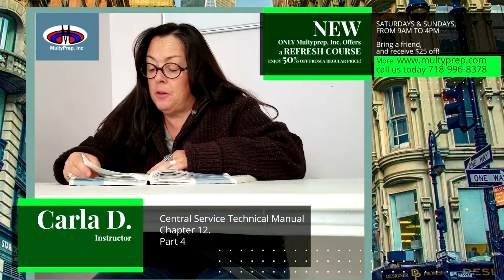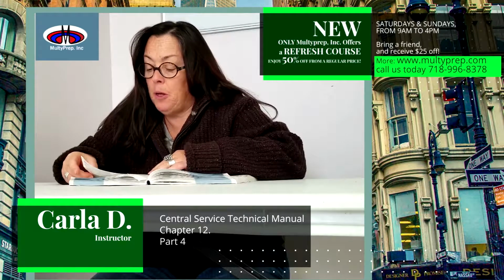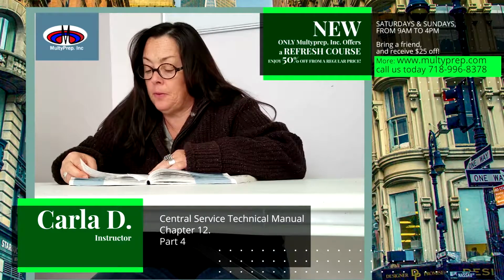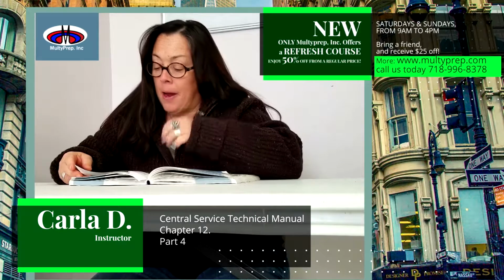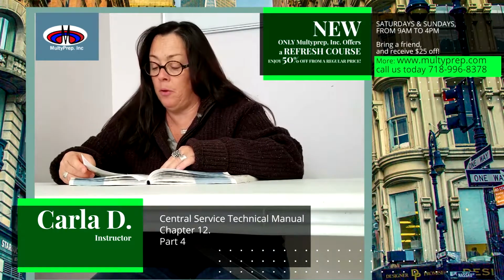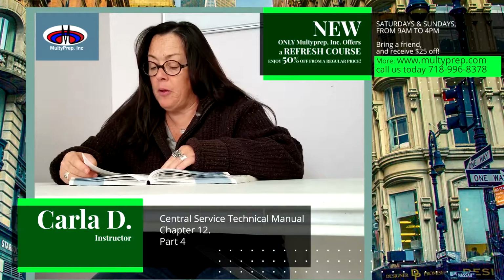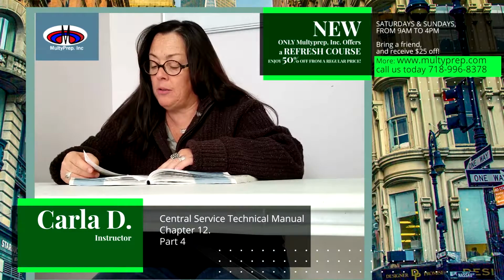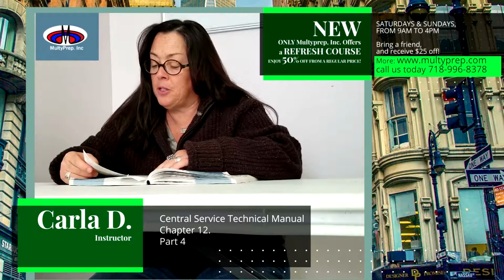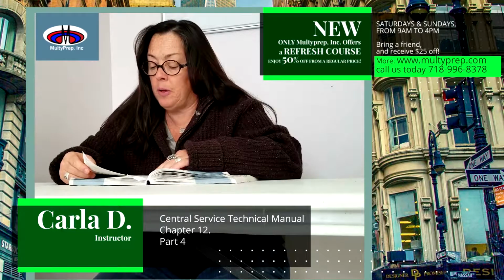Wrapping techniques. Peel pouching techniques are as follows. Peel pouches are usually used for smaller lightweight items. They are also useful when it is important to see the contents of the package, such as when a description of the contents is difficult to view on the label. Peel pouches are available on rolls that allow CS technicians to cut off the length desired for each package, and they are also available in pre-cut sizes.